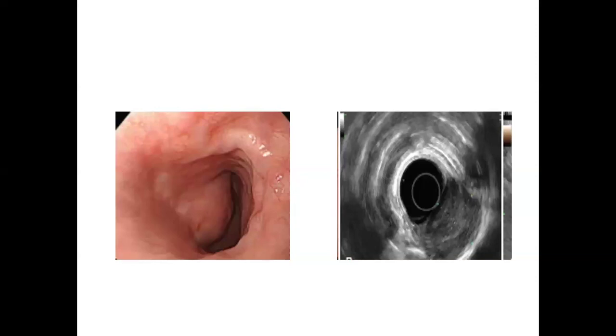When you look at the picture that I've projected, on our left, that is the lower part of the esophagus. We have a swelling down there. When we are doing upper gastrointestinal endoscopy, we have no means of collecting a biopsy which will give us a definitive conclusion in this case. Therefore, there is need for another technique that we can use to enter this region and collect a biopsy, for example. That is now the endoscopic ultrasound that we are looking at on the right side of the screen. It's showing the region clearly, and we can apply color Doppler and get a biopsy using needles that are specialized in doing this task.